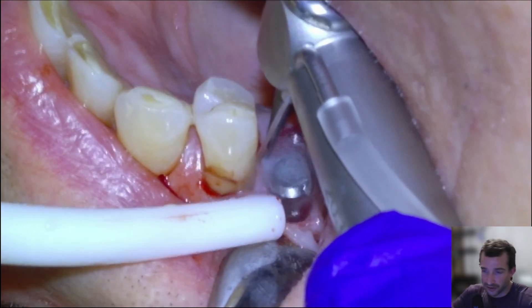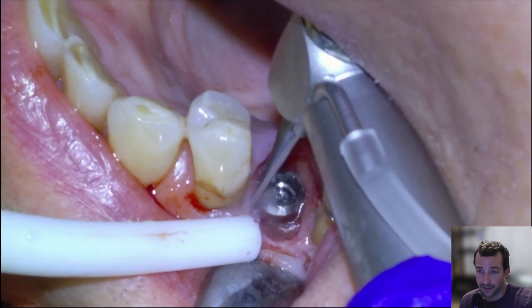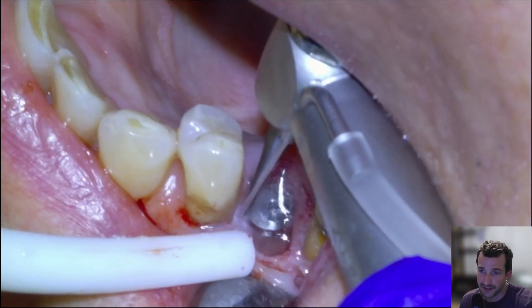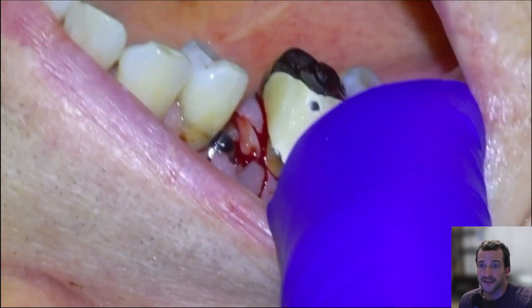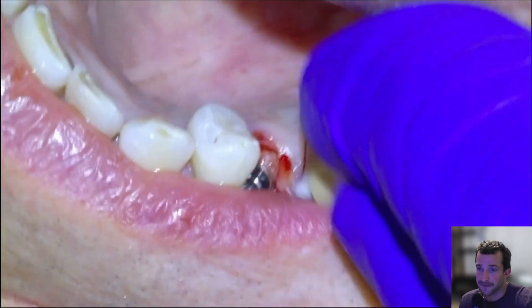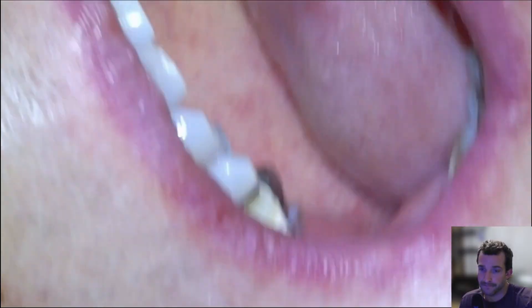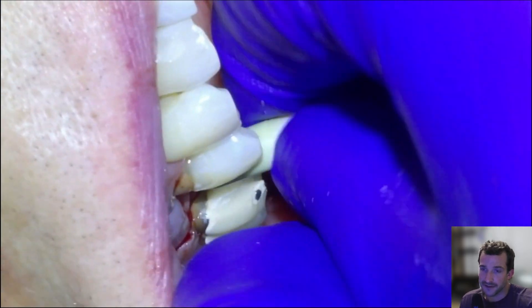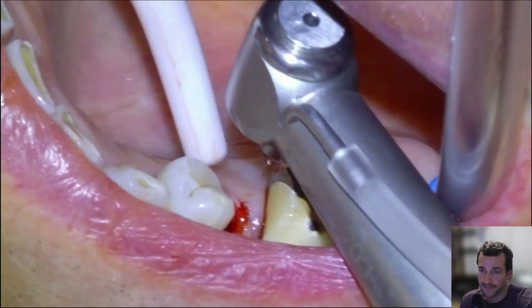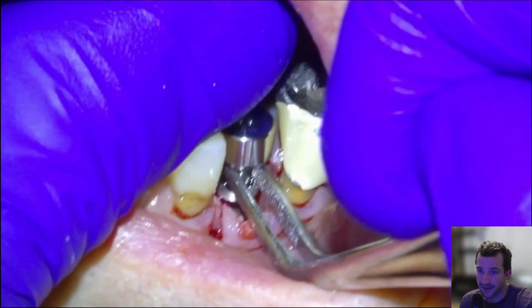Around the collar of the tissue level implant — the polished collar — any areas where it's overgrown by bone, because we like to submerge it sub-crestally, we might need to just remove the bone so that the healing cap can seat passively. We'll get an ISQ on it, and we would expect nothing but green, which we get. We'll take the SmartPeg out, irrigate again with saline to flush everything out, and put our healing cap on.